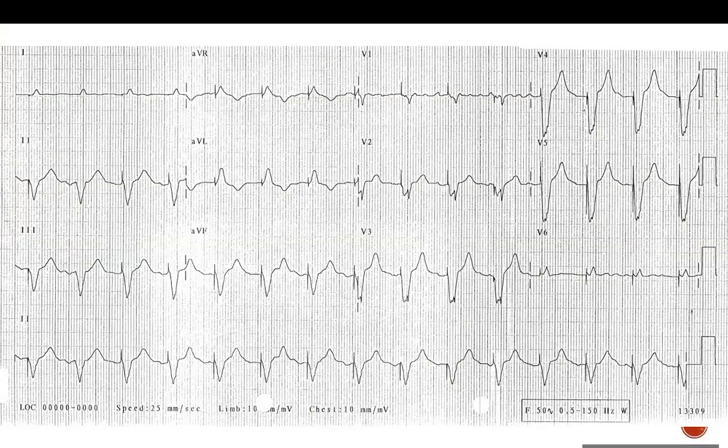So what if you have ventricular on-demand pacing? What does sensing show, and how does sensing work? You see an intrinsic rhythm, right? Yes, that's what sensing is. So you see the amplitude of the intrinsic rhythm, right? Yes, exactly. Intrinsic rhythm of the ventricle, you mean? Exactly, because the lead is in the ventricle.